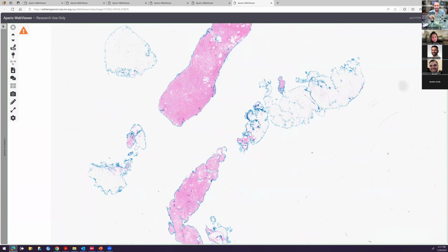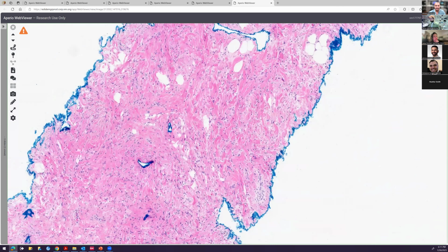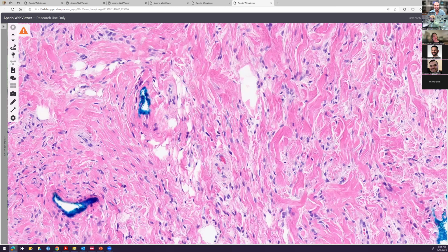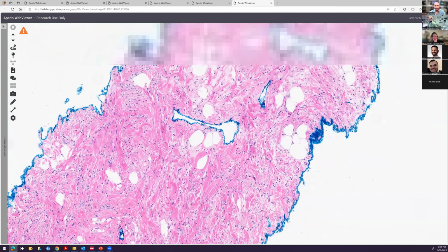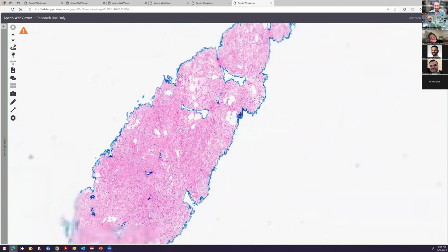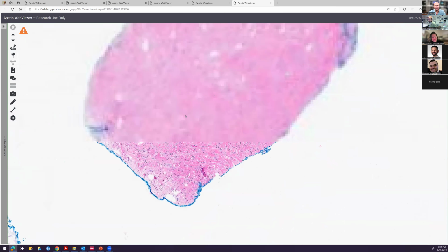And it came with 4 different slides with like 15 different levels, and there were two stereotactic calcification biopsies, and there's like a 3 hour long report that gets signed out after this. It's a breast biopsy, right? So yeah, this is from the breast. At least our breast team is very exuberant about their thoroughness. But yeah, this is from the breast. So what do you think?